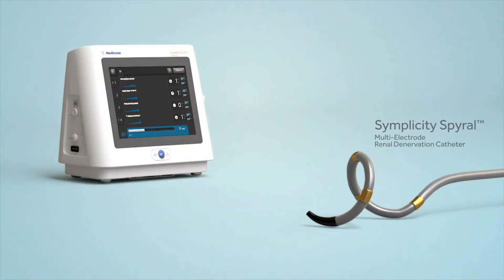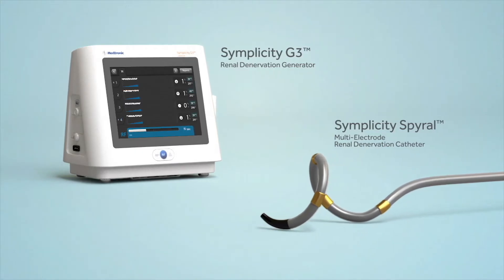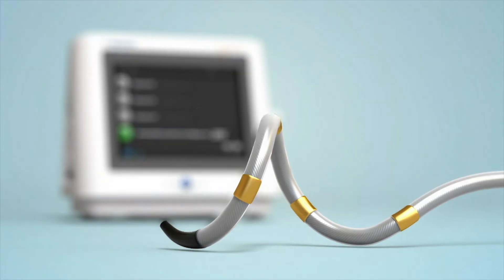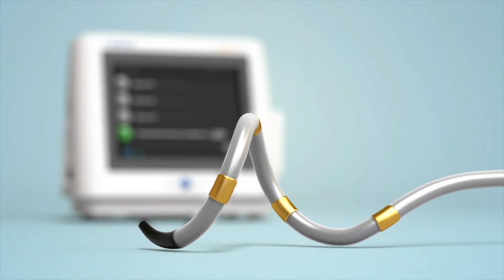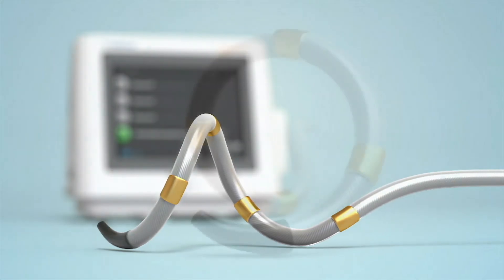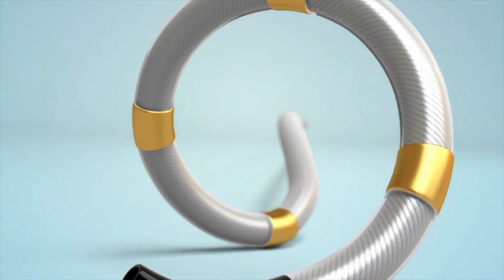The Simplicity Spiral catheter and Simplicity G3 generator offer an extremely efficient and simple method of performing renal denervation. The Simplicity Spiral catheter offers exceptional deliverability and ease of use, short procedure and ablation times, and consistency of deployment in a wide range of anatomies.